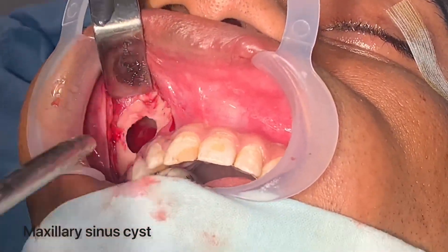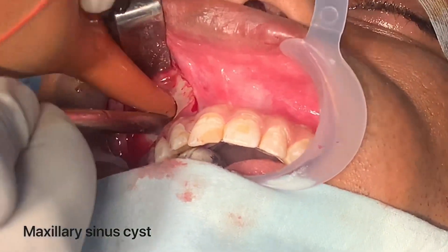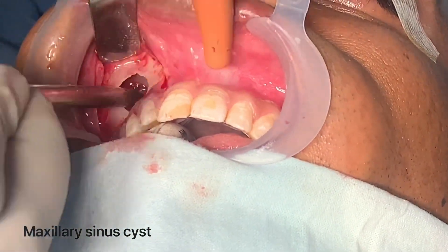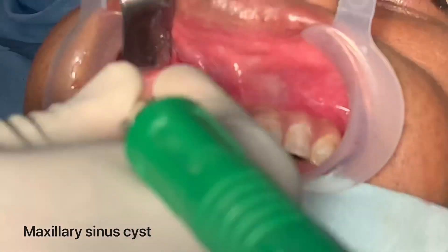You can see the sinus is now pretty much clear and clean. That's perfect — we have a clean sinus.